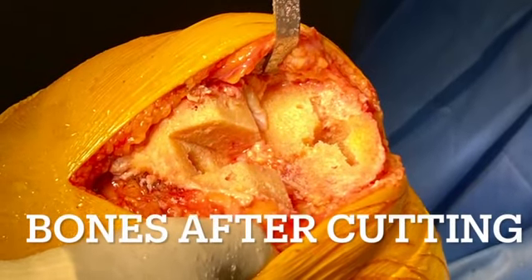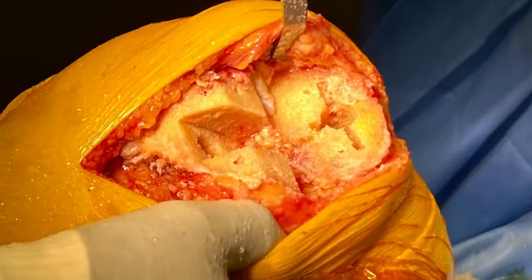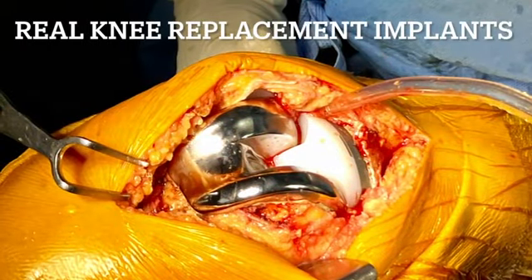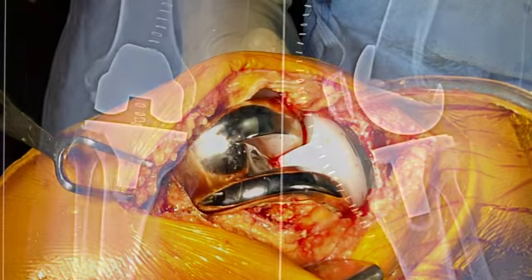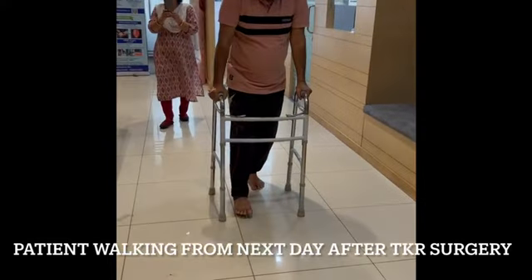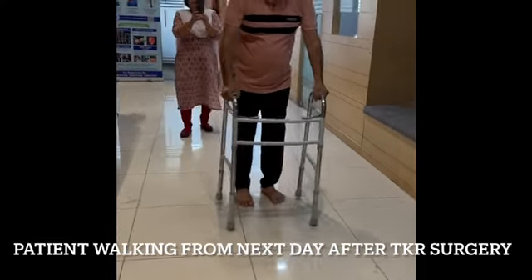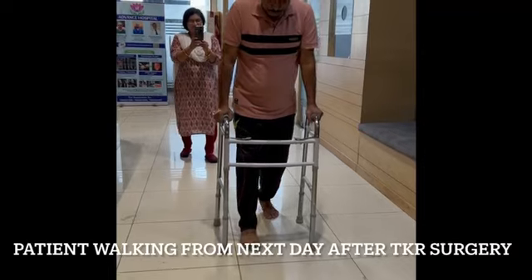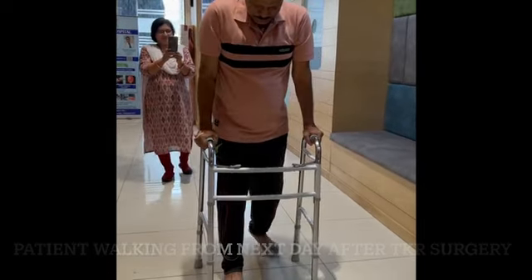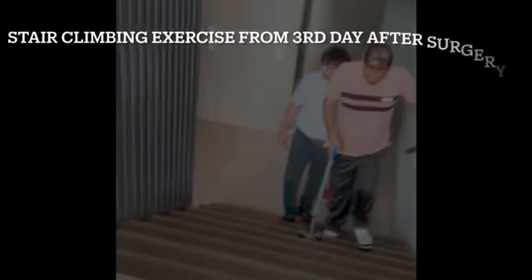This is the image of the bones after cutting, and this is the image of the real implant. And this is the video of the patient walking on the next day of surgery. And the patient is usually allowed to walk with full weight bearing, walking with the walker, as well as stair climbing on the third day of the operation.